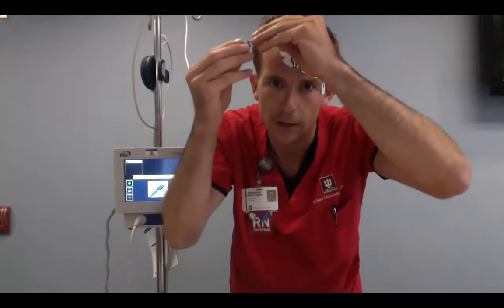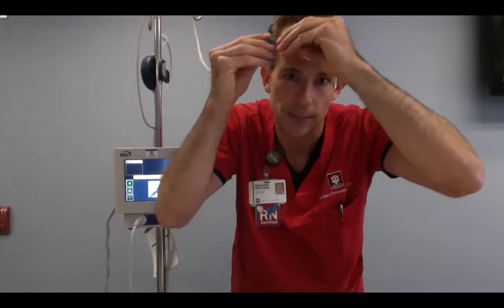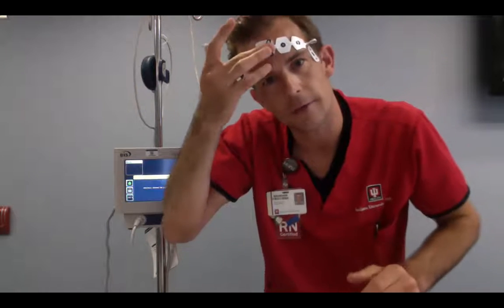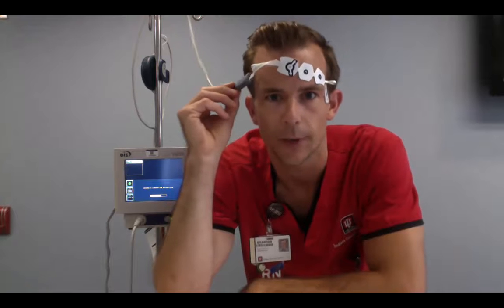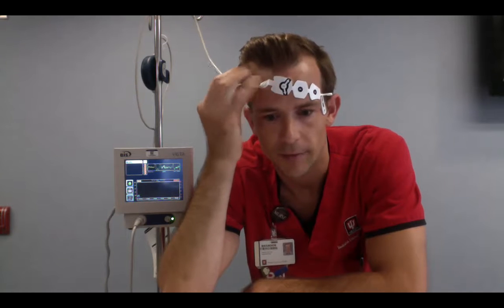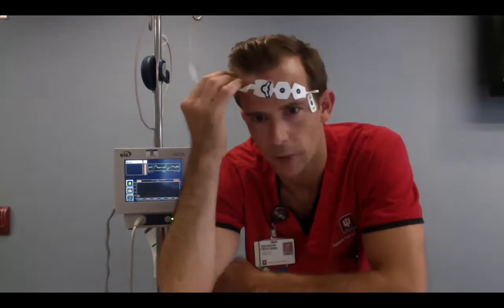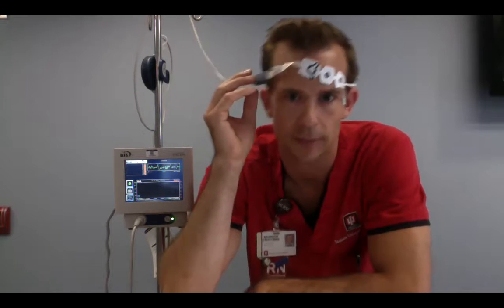Before you put this on, you might want to wipe down their forehead with alcohol and make sure it's dry. Sometimes you can use skin prep if their face is super greasy or they're really diaphoretic. And then another thing is this can weigh down, especially when you're proning them. So you might want to tape it to the patient's forehead if you need to. It's really unfortunate when you have them all packed up in the bed and then get them flipped over, and now you don't have a signal because this has pulled loose. So maybe tape it if it applies to your patient.